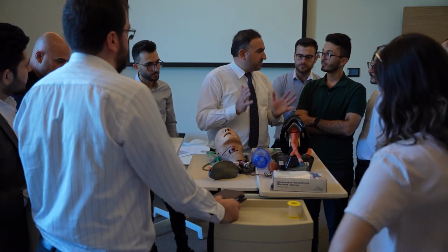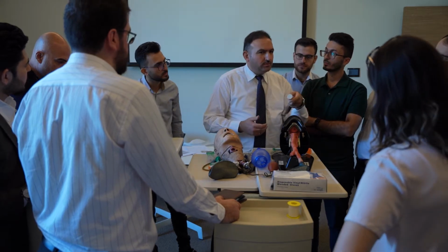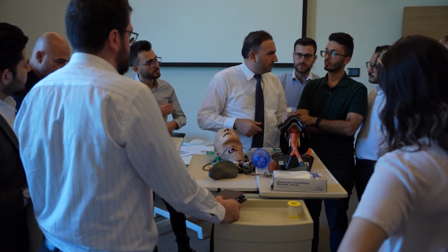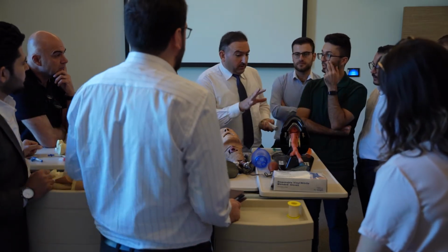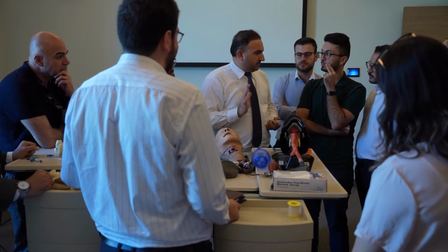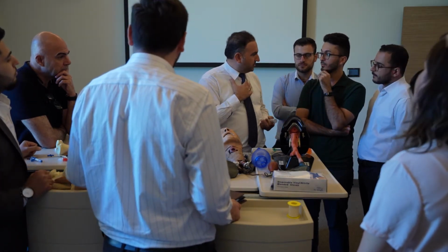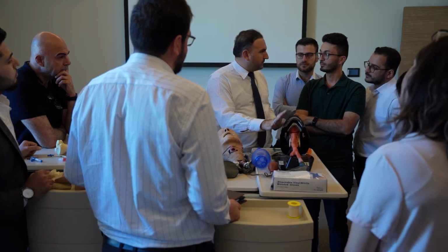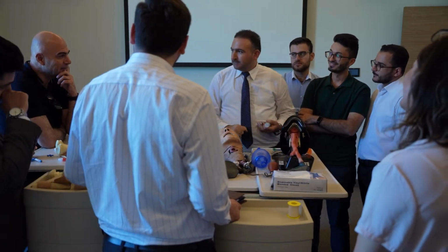The important thing is to oxygenate the patient. Don't try too much to put in the tube. Ideally it should be within one minute, two minutes, or less. This patient is like you; sometimes they advise you to hold your breath. When you need oxygen, the patient needs oxygen. So if you cannot succeed, hold your breath and let us see how much you can withstand.